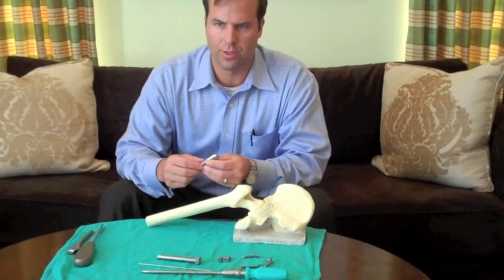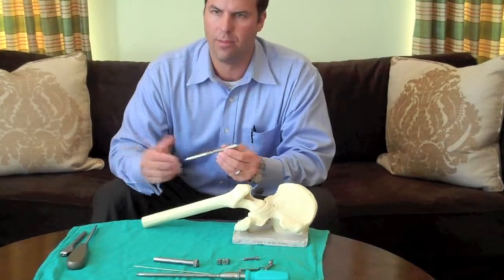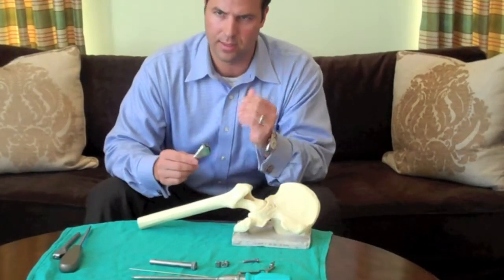I'm William Kurtz. I'm an orthopedic surgeon here in Nashville, Tennessee. I'm going to discuss the In Situ Leg Length Guide and In Situ Femoral Preparation.